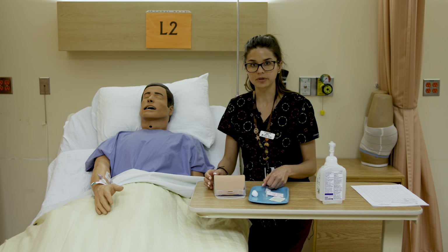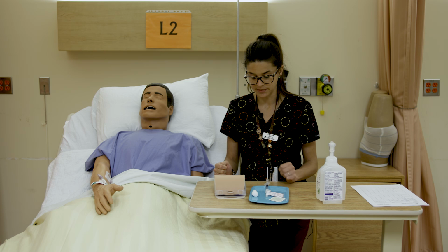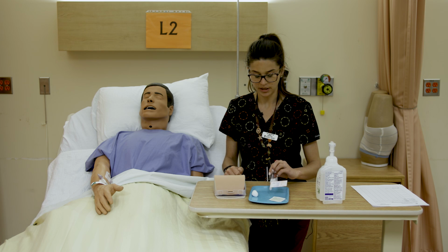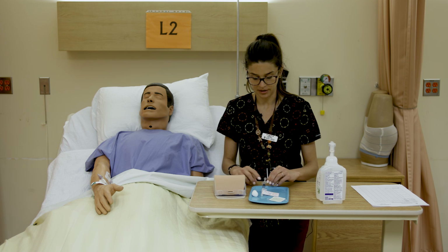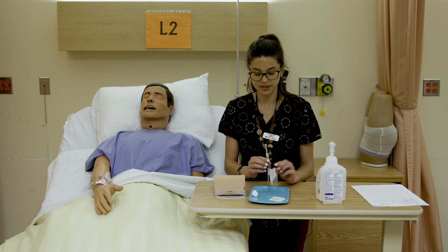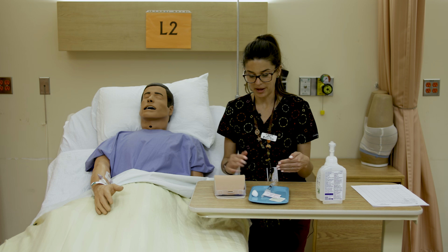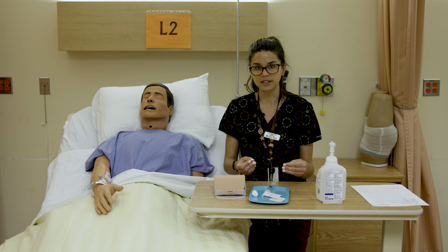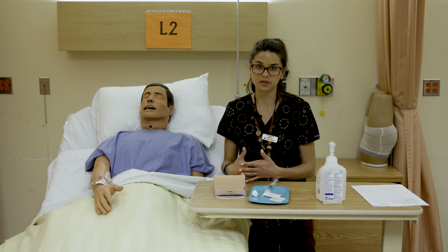So that's Z-tracking. The other difference with IMs and your other injections is that some places will want you to aspirate when giving an IM, and some places don't need you to, but some agencies do prefer it. The reason for aspiration is to determine if you get blood in the syringe, which means you've actually gone into a vein and not muscle tissue. If you did see blood when you aspirated, you would want to start over again, because then you're not delivering it to the correct route.